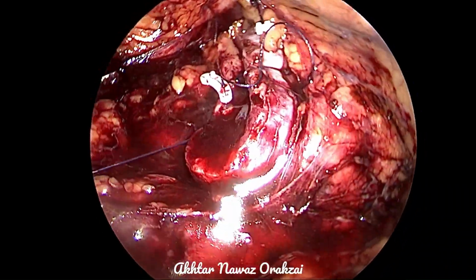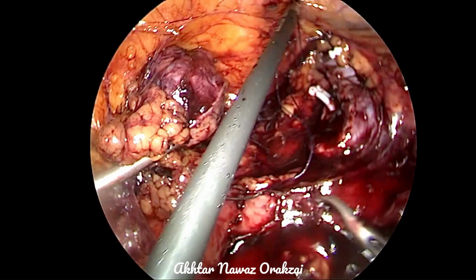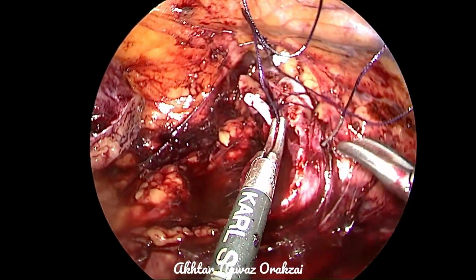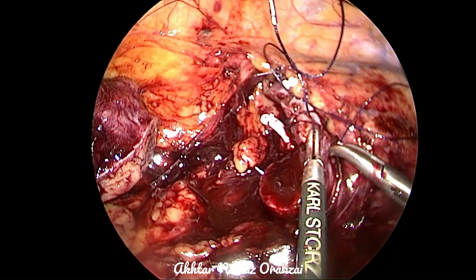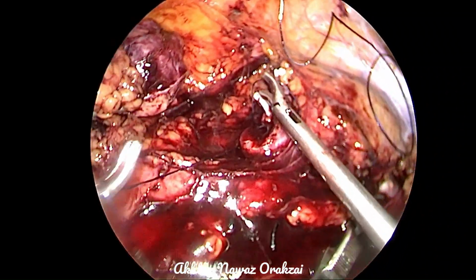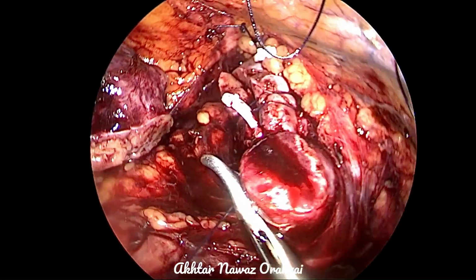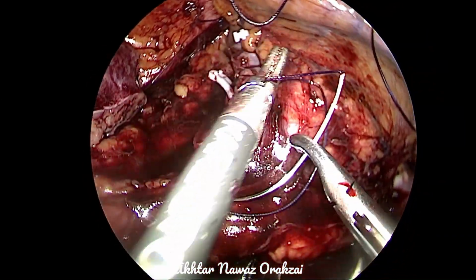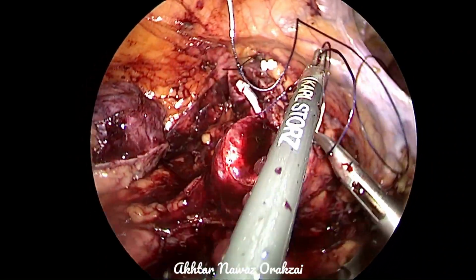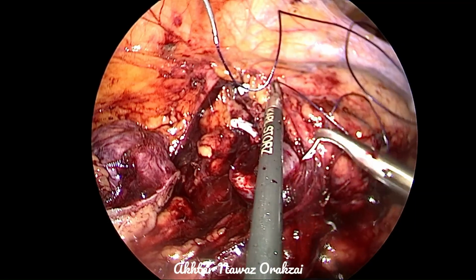We are using Vicryl 2.0 here, and also applying the Hem-o-lok clips to make it tight. Otherwise, we could have used a V-Loc suture or Stratafix for that matter by Ethicon, which does not require these Hem-o-lok clips. But those sutures have some disadvantages. They are monofilament and difficult to handle. There are also chances of breakage because they are monofilament. And number three, last but not least, is the price.